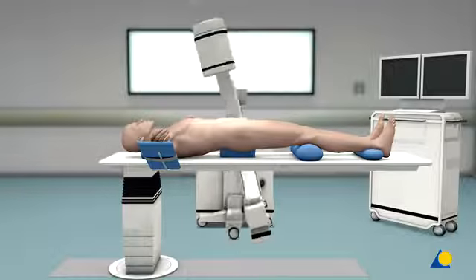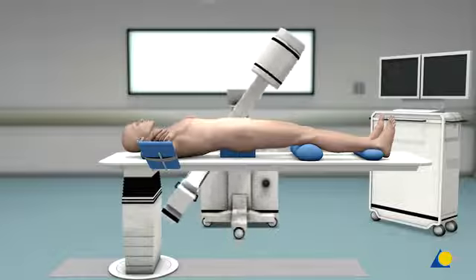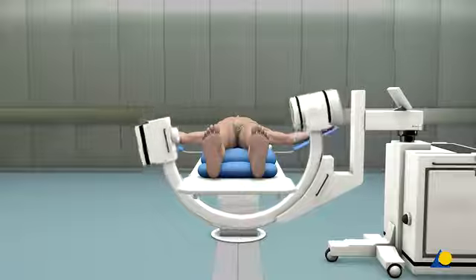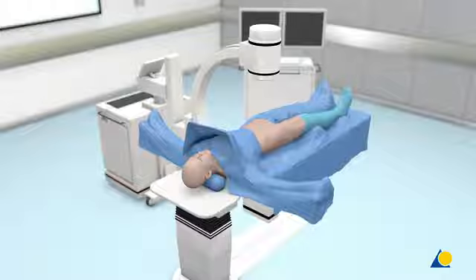The posterior pelvis must be well visualized in all views. If it is not, the percutaneous insertion of screws is not feasible. The patient is prepped and draped so that the involved side is available down to the OR table. The involved leg may be free draped to allow for traction and manipulation if a closed reduction is necessary.